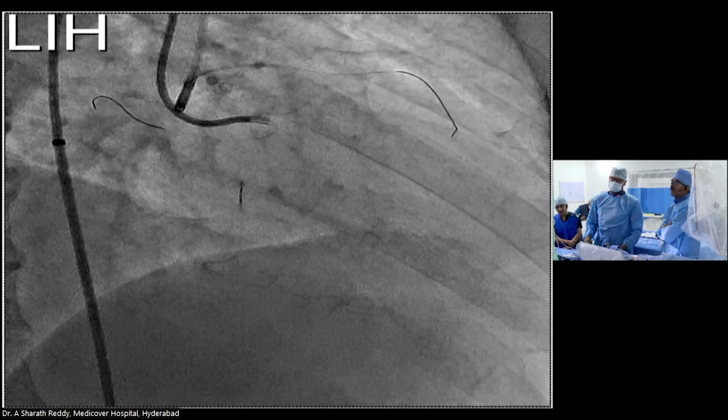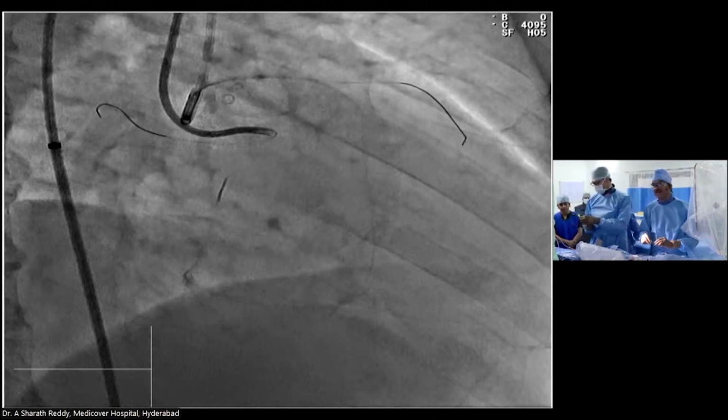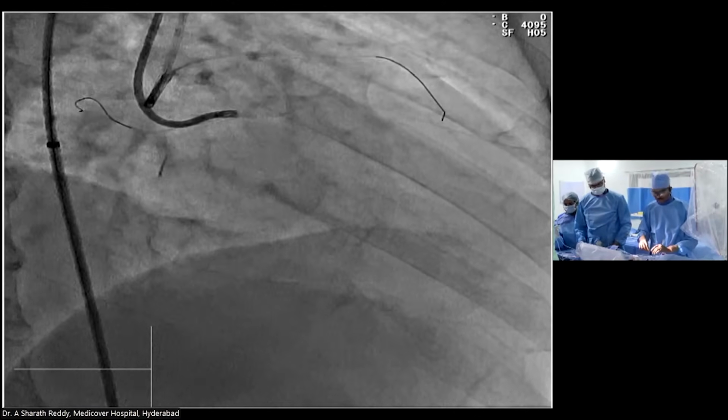And here you see that there will be a problem because you actually have no marker of your proximal cap. Gaia 2 is already open. Okay. Since Gaia 2 is already opened, I'll just check my luck here. I think we stay a little bit with you for another 3-4 minutes because that is an important step, and it's sometimes good to have a live step in a live transmission and not prerecorded.